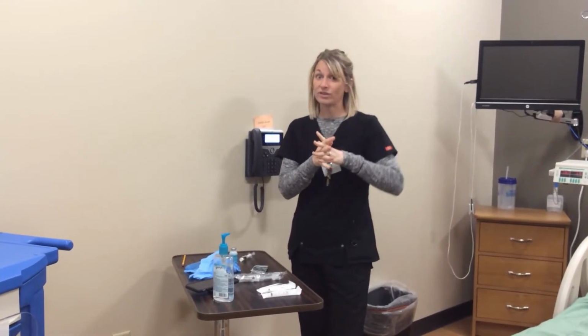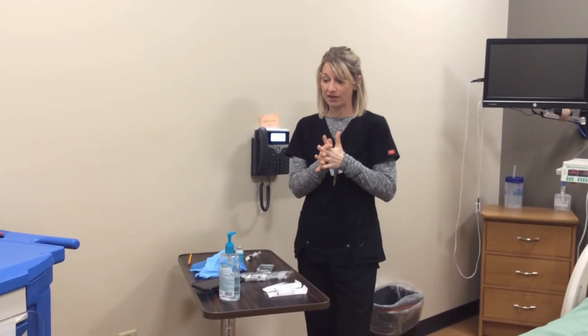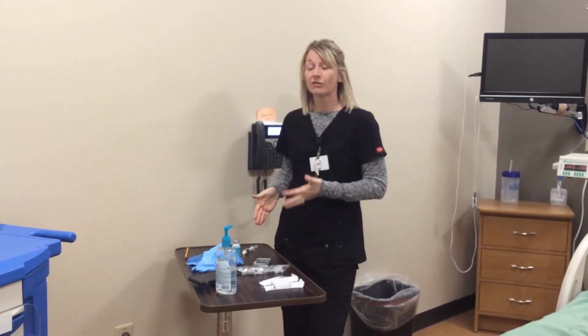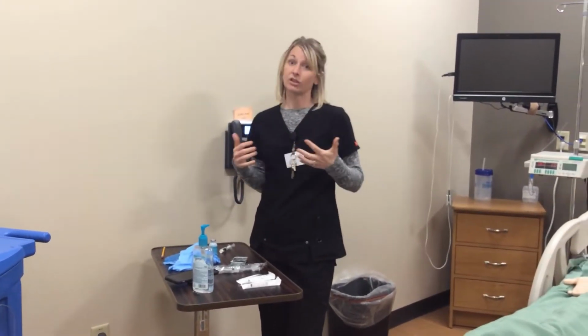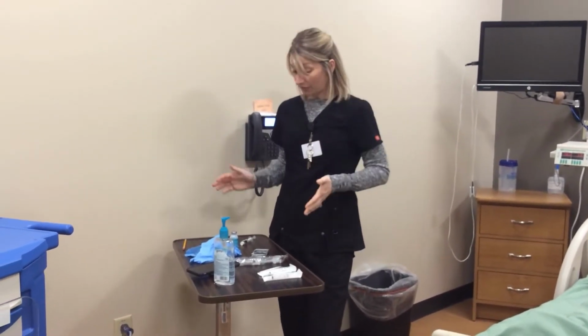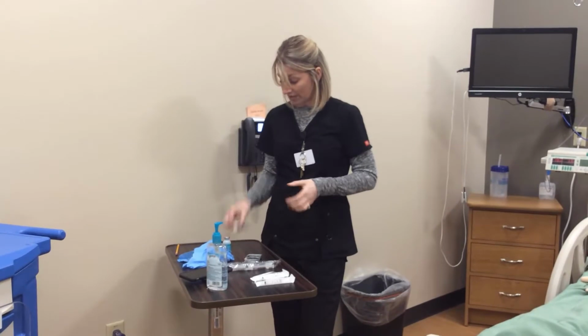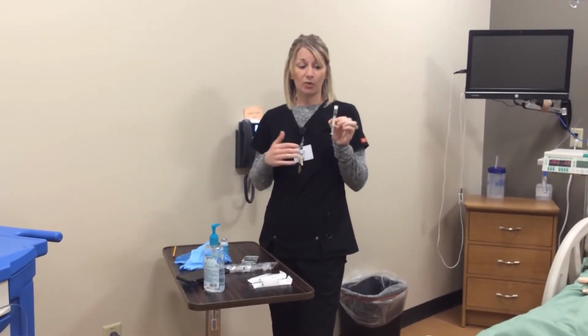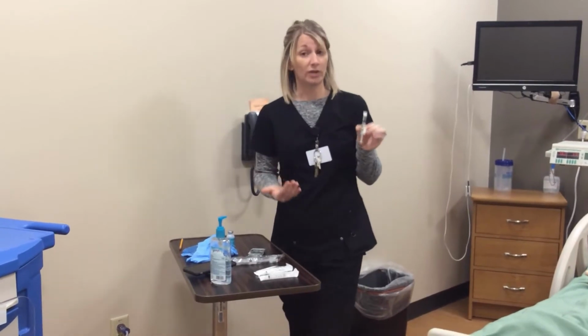So what I need to do is waste the rest of that medication, especially since it is a narcotic. I'm going to be very careful with this, and I'm going to grab another RN right away to verify my waste. Before I even go into my patient room, I know that I need to waste this with somebody else. And when I say waste it with somebody else, they need to actually witness me waste it.